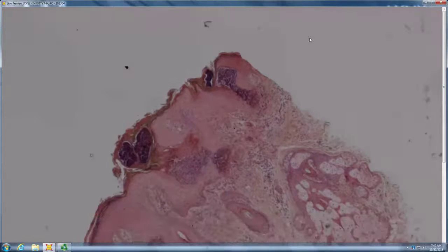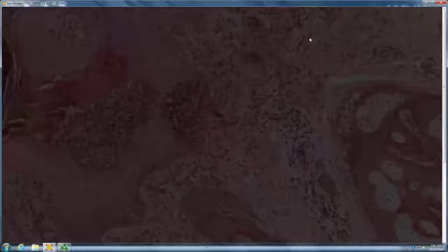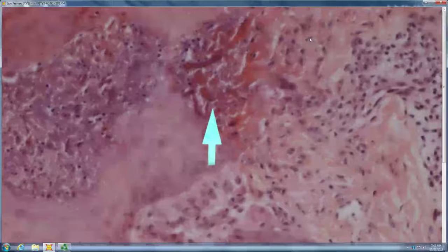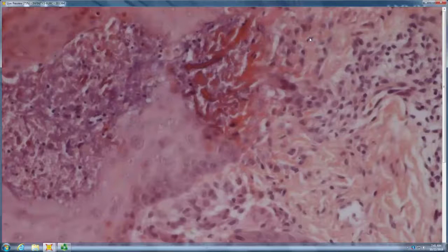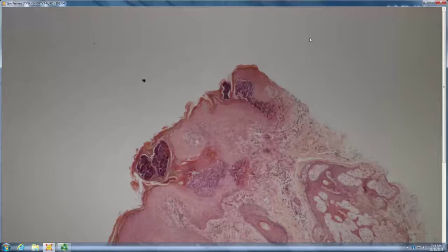Yeah, it looks like we have a perforating disorder of some sort. Perforating disorder. And is the channel straight or serpiginous? It's pretty serpiginous. And is it collagen or is it altered elastic? It's more like elastic, like altered elastic fibers that turn red and are spit out through a serpiginous channel. So do you know any kind of elastosis that's perforans and serpiginosa? More like that. Elastosis perforans serpiginosa, EPS. And where does EPS tend to occur? The neck. It's often agglutinated papules, or sometimes in a serpiginous array on the neck as well. So the serpiginosa refers both to the histologic appearance and the clinical appearance, but they can just be agglutinated grouped papules on the sides of the neck as well.